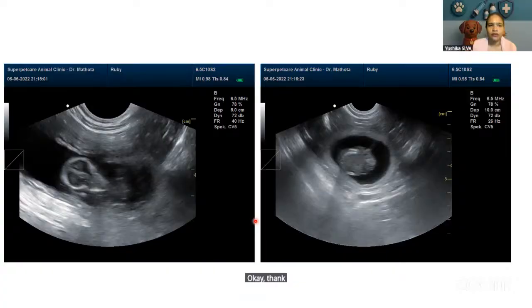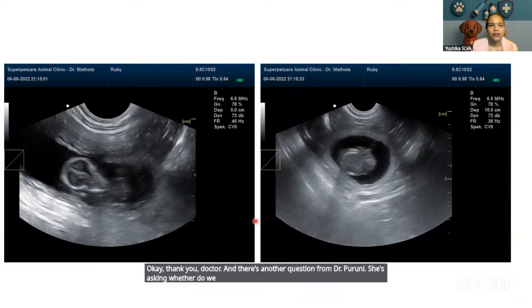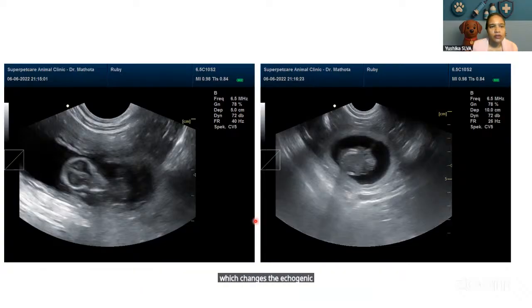Okay, thank you, doctor. And there's another question from Dr. Purni. She's asking whether we have to do echogenicity comparison in all the organs, because if there are abnormalities in both organs which change the echogenicity in both, how do we express echogenicity in them?